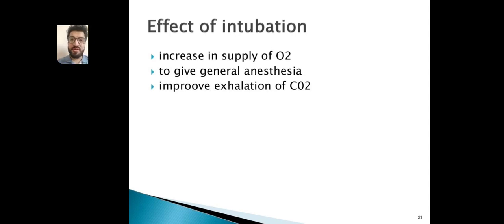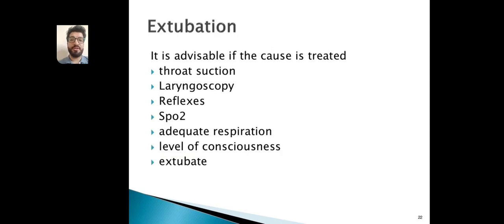In that method we use inhalational agents like isoflurane, sevoflurane, desflurane, etc., and once they are delivered to the lungs, they diffuse into our blood and cause anesthesia. Also intubation can improve the exhalation of carbon dioxide. The carbon dioxide can be exhaled in a better way. So that is also a good effect of intubation.